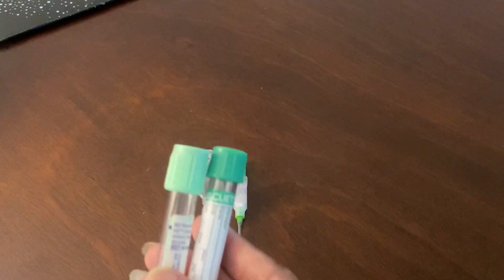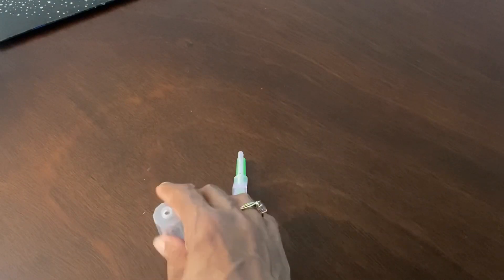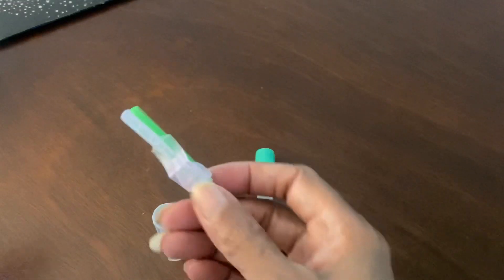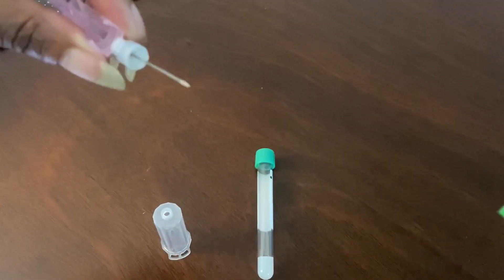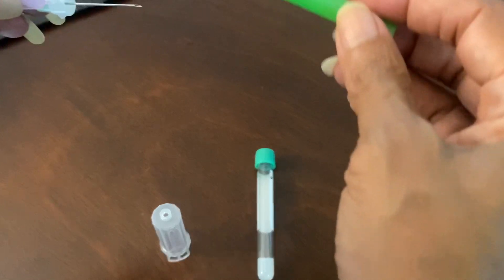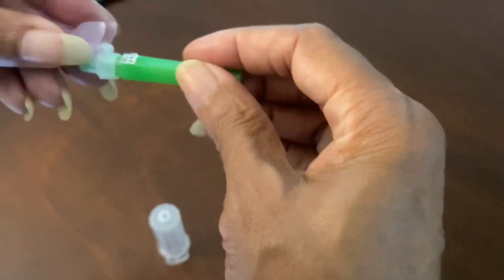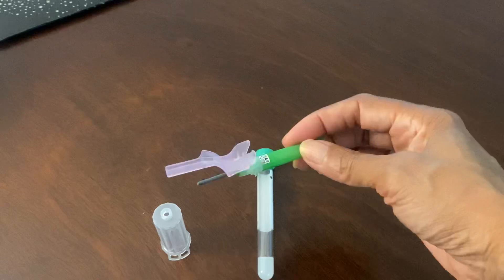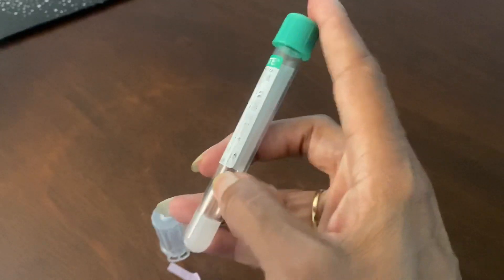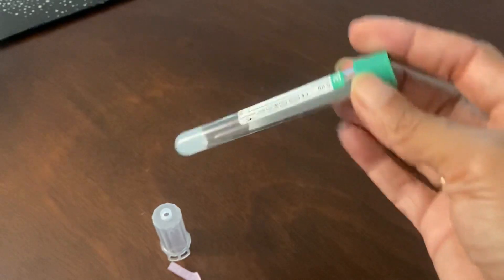These tubes, the holder, and the needle are used together to collect venous blood. You are not supposed to use these needles for anything other than sticking a vein and collecting blood. They're not designed for grafts, fistulas, or arteries. These tubes have a predetermined vacuum in them so that they draw the exact volume of blood needed for testing and analysis.